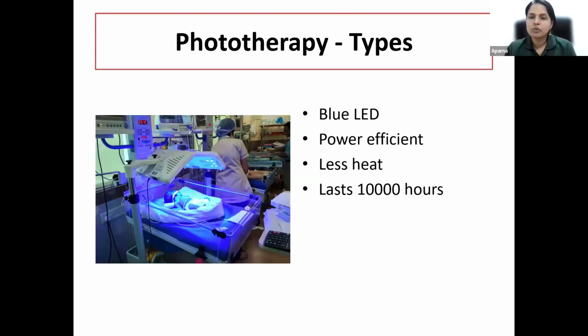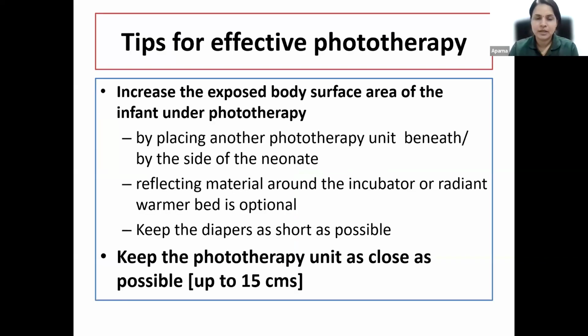Whereas most of the units now use the LED lamps, or light emitting diodes, which are made up of gallium nitride crystal. The LED lamp, in contrast to the compact fluorescent lamps or CFL lamps, emits less heat. They also emit less infrared light and ultraviolet light, so they cause less environmental pollution. They also result in less heating of the baby. They are power efficient. They consume less power as well. So they have so many advantages that most units now prefer to use them. They also last for a longer time, for as long as 10,000 hours, and hence the need for changing lamps and all that doesn't come into place.